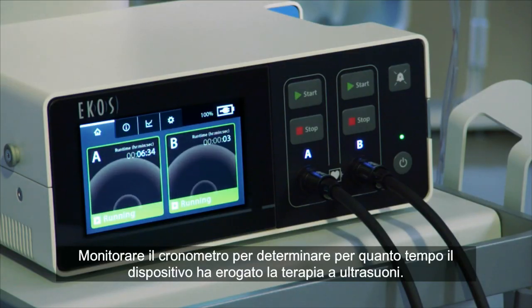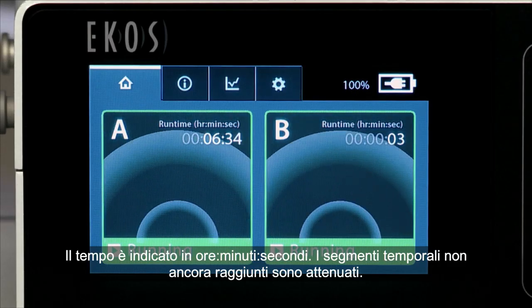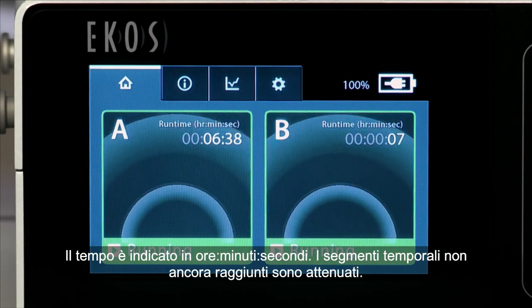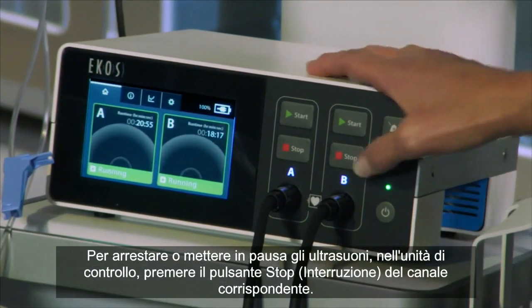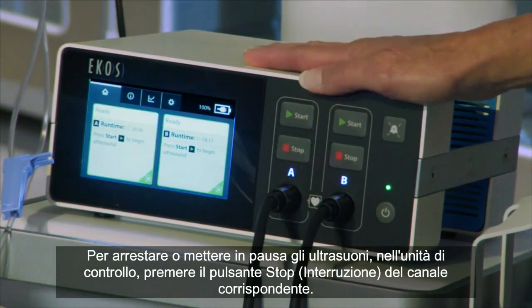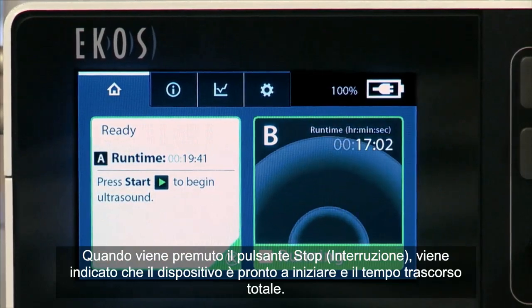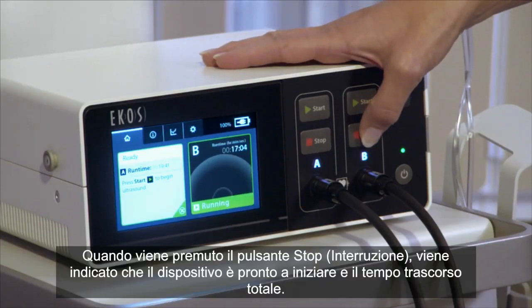Monitor the timer to determine how long the device has delivered ultrasound therapy. The time is shown in hours, minutes, seconds. Time segments not yet reached are dimmed. To stop or pause the ultrasound, press the Stop button on the control unit for the appropriate channel. When the Stop button is pressed, the Ready to Start instruction and total elapsed runtime is displayed.